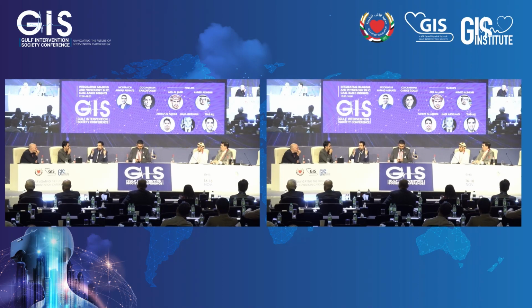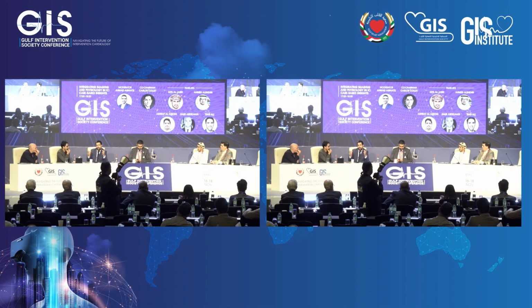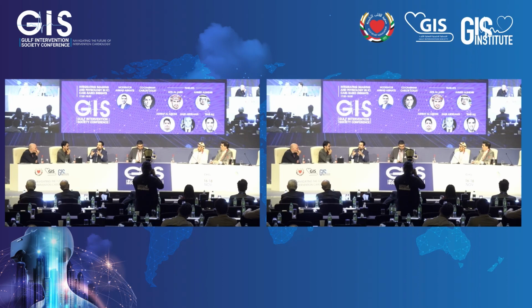The second thing that we have found is that there is no relationship between the pattern of epicardial disease and the presence of microvascular dysfunction. That I agree. Everybody says diffuse disease is linked with microvascular disease, but there is one IVUS study linking that, of 43 patients. That's the only thing in the literature. This is why we have been looking at that, and we have found zero association between diffuse disease and microvascular disease.